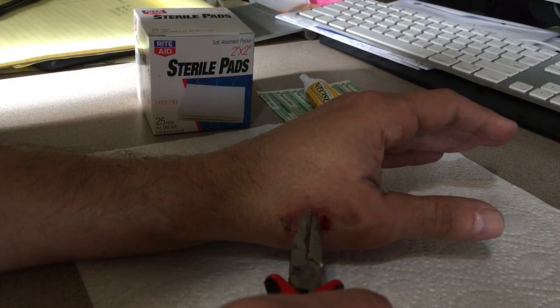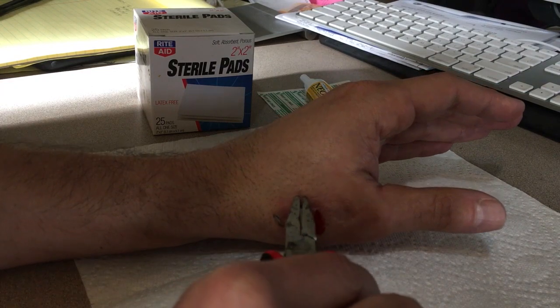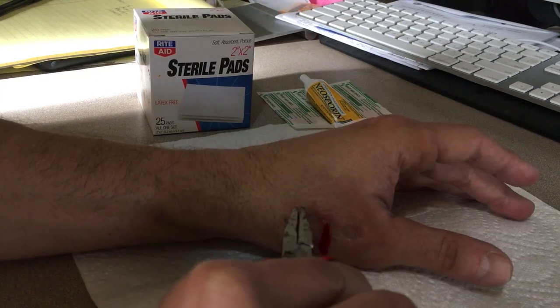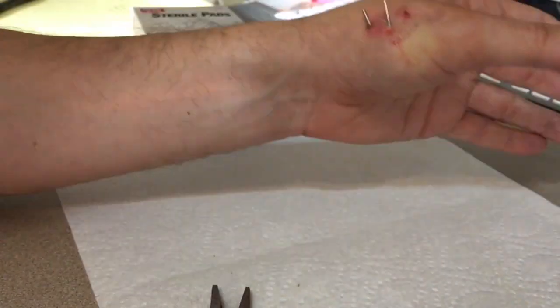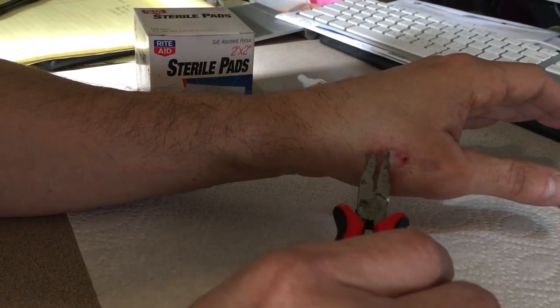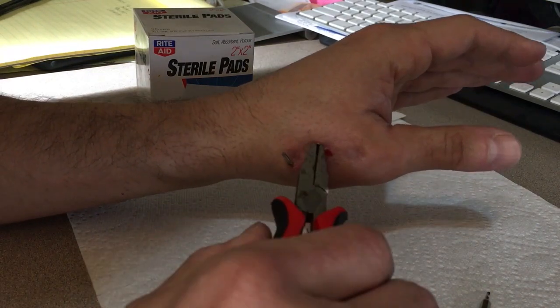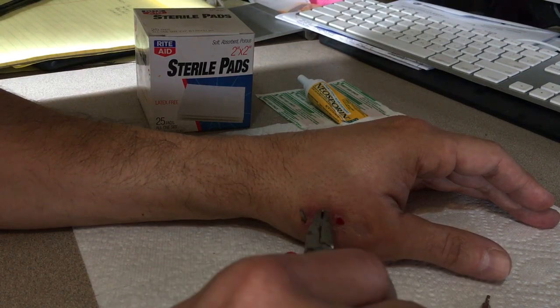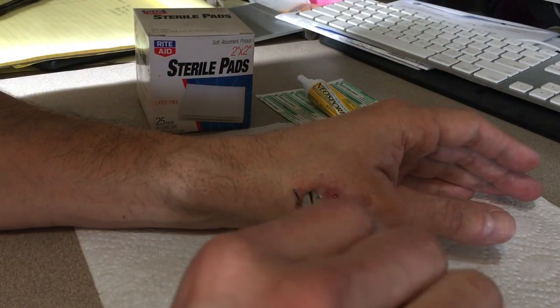This one I'm not sure - definitely a little tighter. Just trying to work it loose a little bit. Yeah, this one's in there a lot tighter.